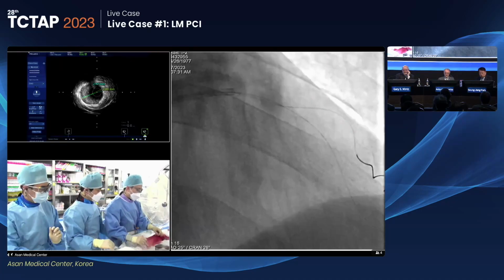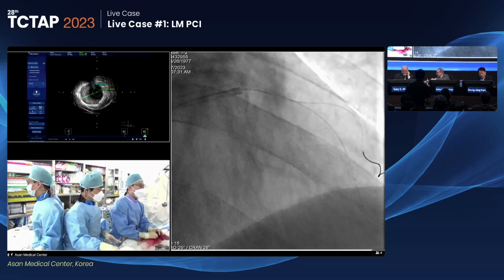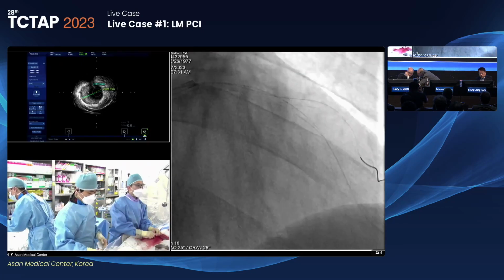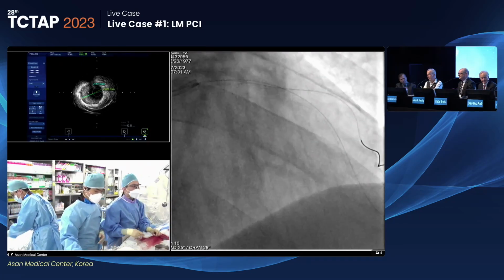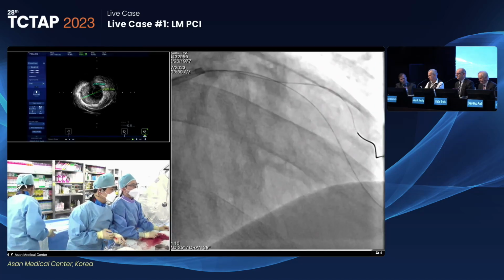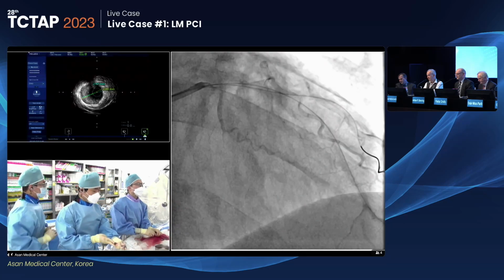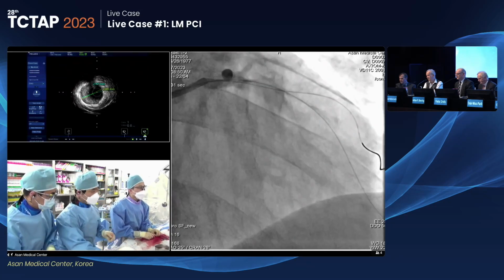One of the other options at this stage, if you were determined to put a stent in there, is to be brave enough to pull your LAD wire back, because there may be some wrap issues preventing delivery. What would you do then, right? Totally. There is so much overlap in the angiogram, Dr. Kang, that it's just difficult.